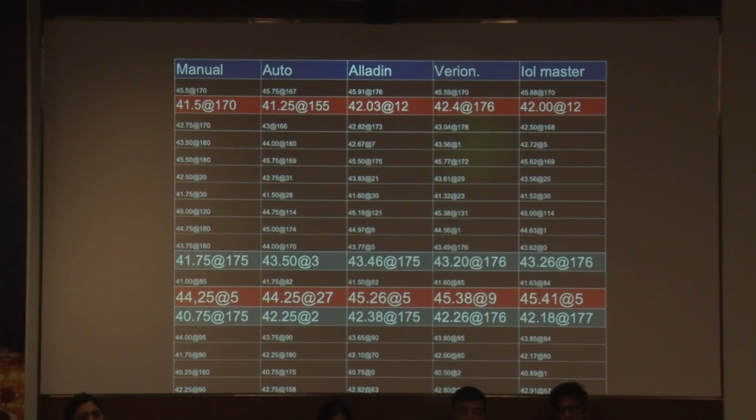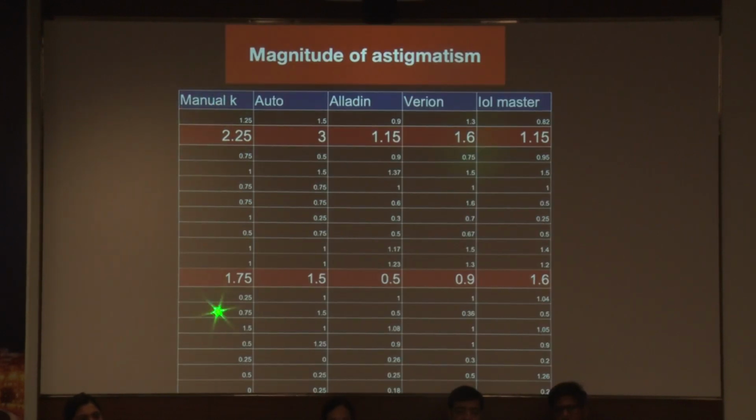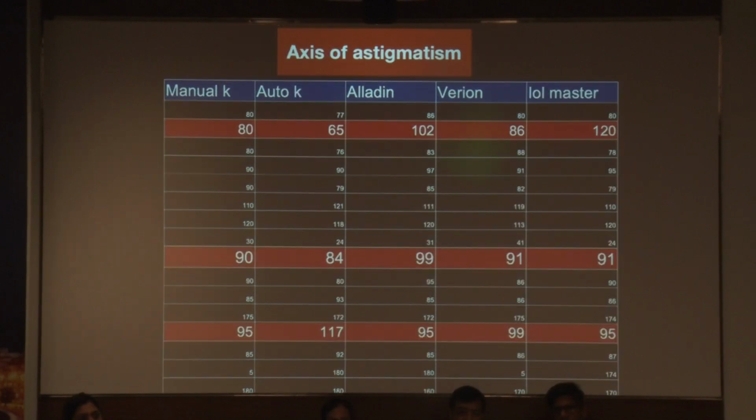So we did a very small study where we checked all these standard equipments on normal optometrists' virgin eyes, not touched. You can see for yourself the highlighted readings are quite different in about 4 out of 19 eyes. So much variability can happen in a normal population. Imagine the patients who are coming to you for toric. The magnitude of astigmatism can vary from 2.25 to 1.6 in this example, from 0.5 to 1.75. Even the axis, see this example, 117, 95, so much variability in axis.